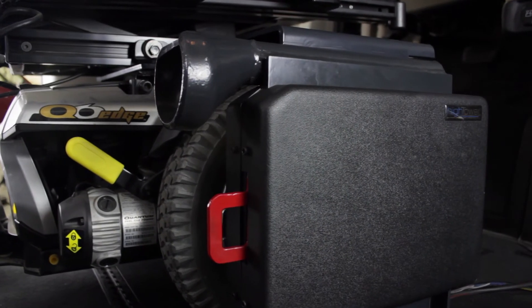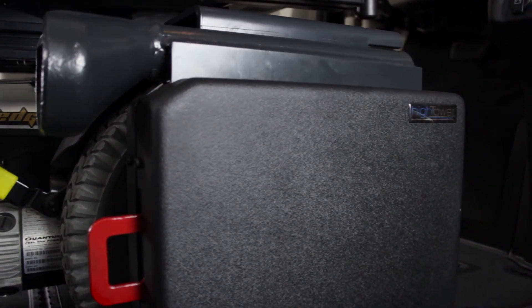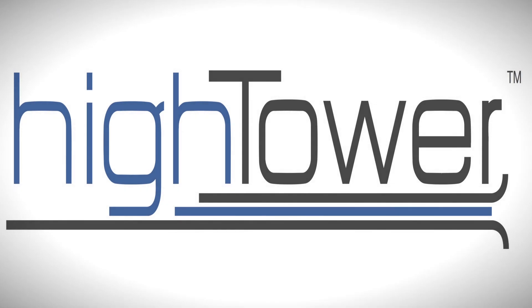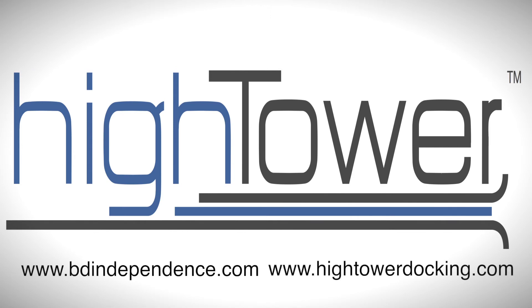After the final fit and function test, you have successfully installed the Hightower Docking Station into the minivan. B&D Independence appreciates your time and input into the Hightower Docking Station process. If you have any more questions about Hightower Docking or B&D Independence, visit us at www.bdindependence.com or www.hightowerdocking.com.